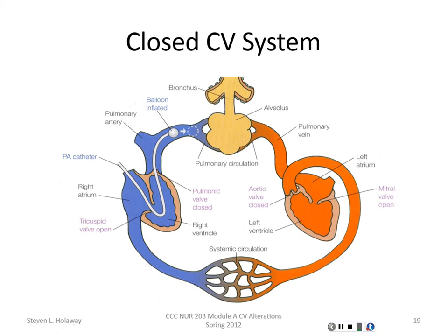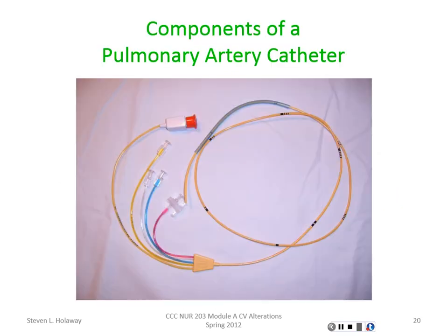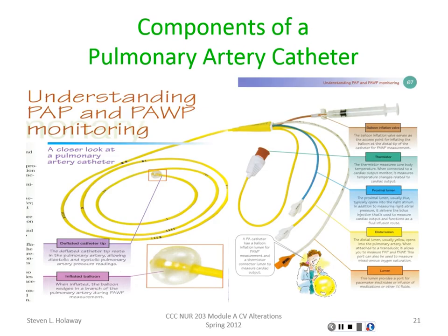So we're not directly measuring pressures within the left ventricle or the left atrium. We are actually using basically mathematics, if you would, to measure those pressures using some different types of formulas. You don't have to learn any of those formulas. You just need to understand that we're measuring those pressures indirectly, not directly. And you'll kind of see as we go through those.